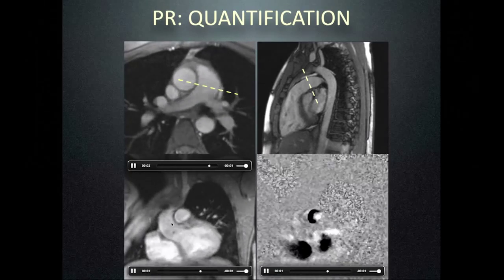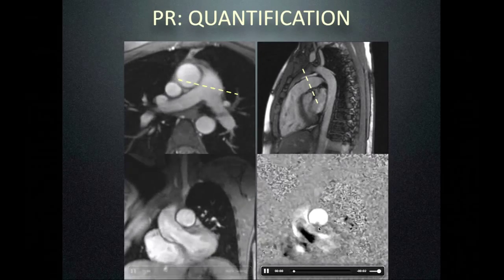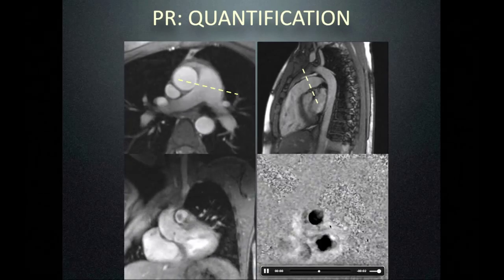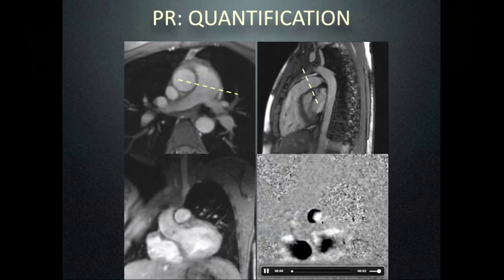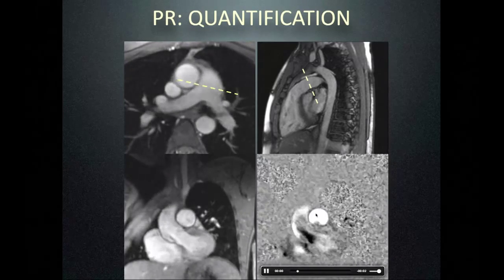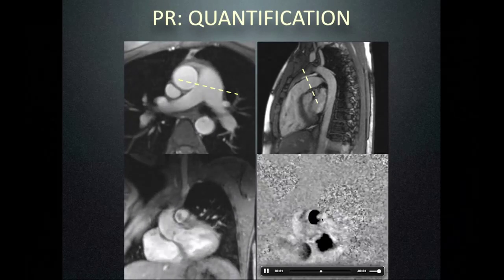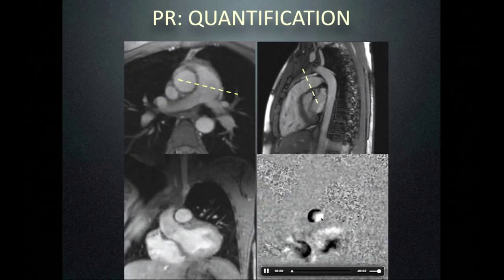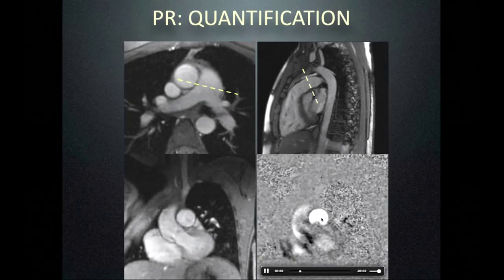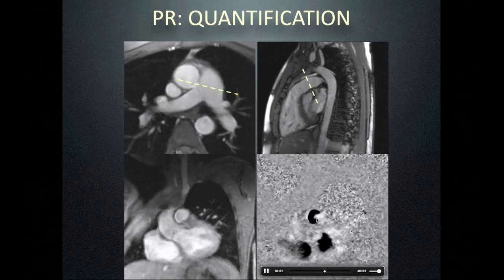And then you can see that it comes with the anatomical imaging and the flow imaging. The flow image appears very, very dirty looking, but it has a lot of information. White is forward flow, black is retrograde flow. And the importance is that the signal is across the whole cross-sectional area, which means that in echocardiography you have only a little bit of sample here, therefore you don't know the whole scenario of blood flow across the vessel.